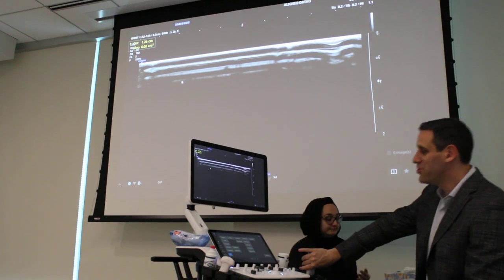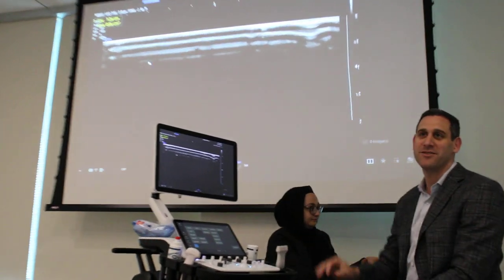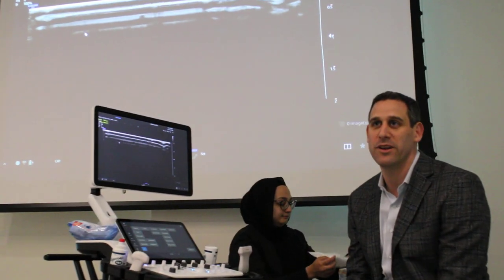That's just an example of ultrasound and what the experience of someone coming in for carpal tunnel syndrome would have at WSMI.